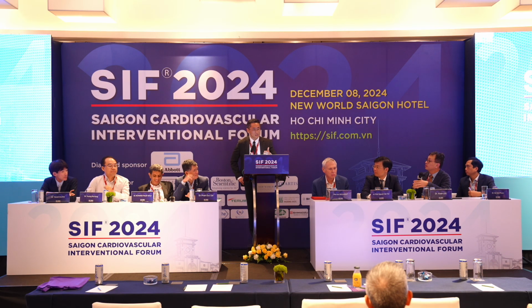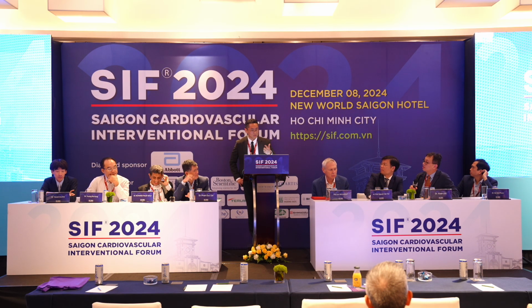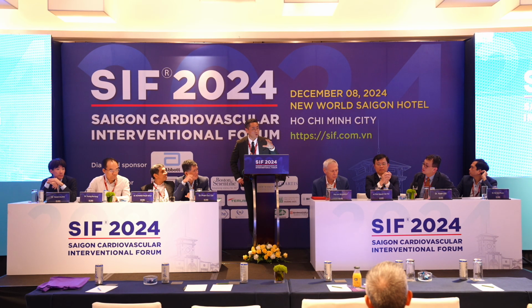The OCT clearly shows the minimal stent diameter in the underexpanded stent, and we can see the EEL. So that's why I just increased up to the 1.75 and then did the follow-up OCT.